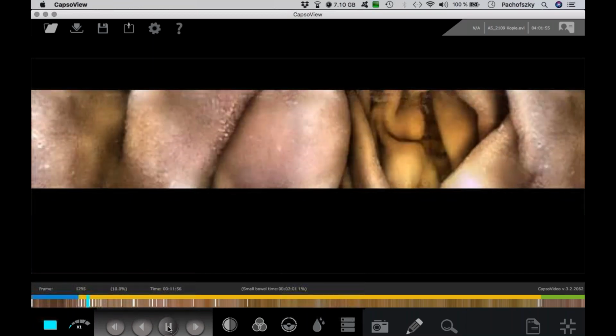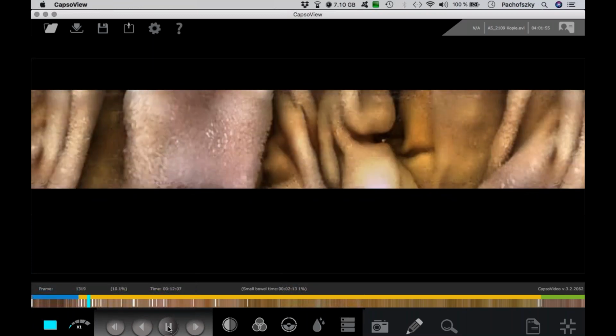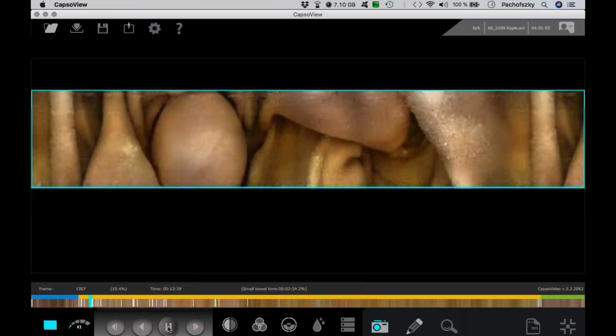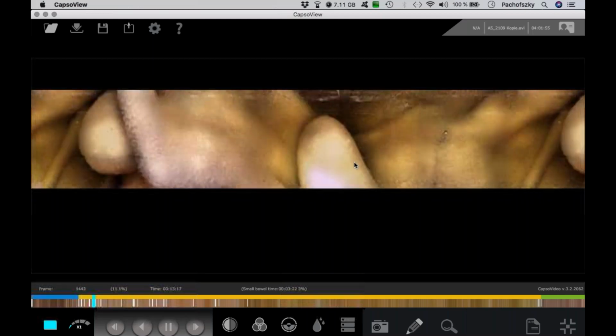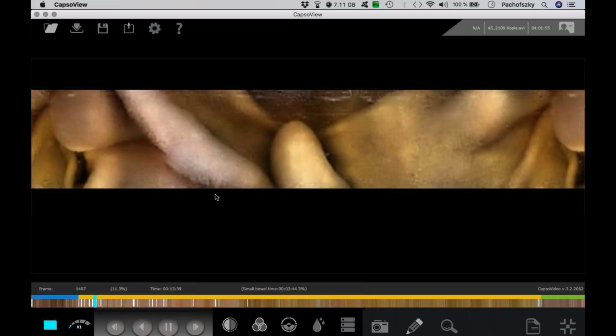And as you have seen in the video, the lipomas start quite after the papilla Vateri. So it was not seen in a routine gastroscopy. This was a patient with a severe iron deficiency anemia, never seen melena. And so we performed upper GI and lower GI endoscopy. Here again, a lot of lipomas in this area and without any pathology.